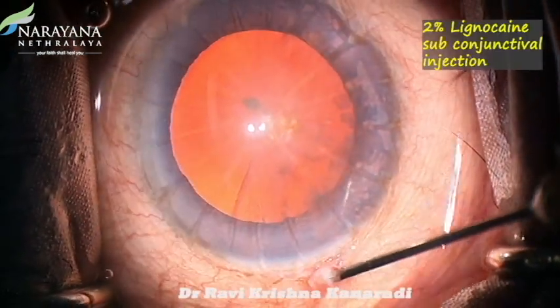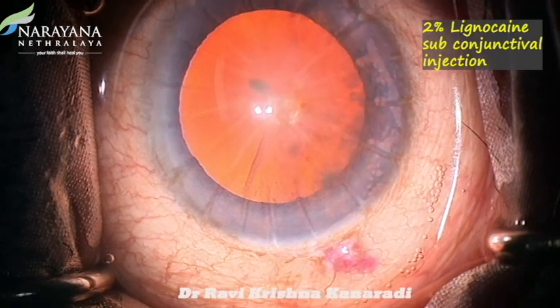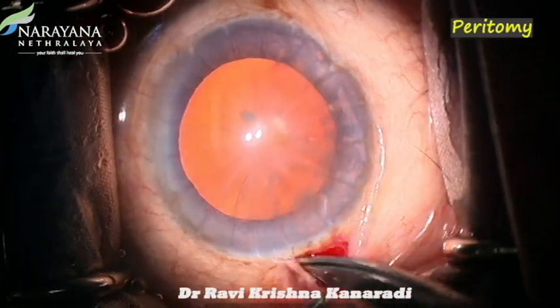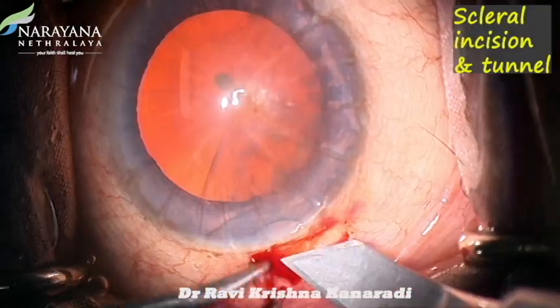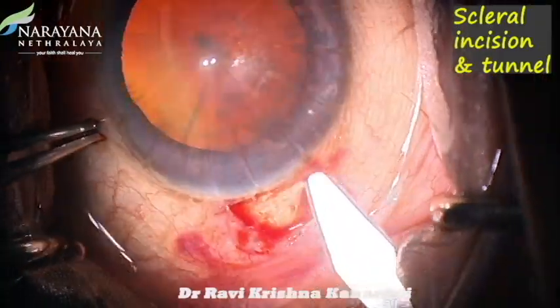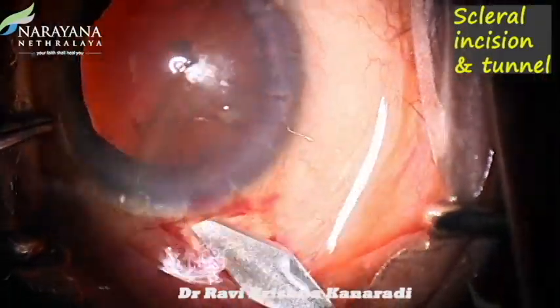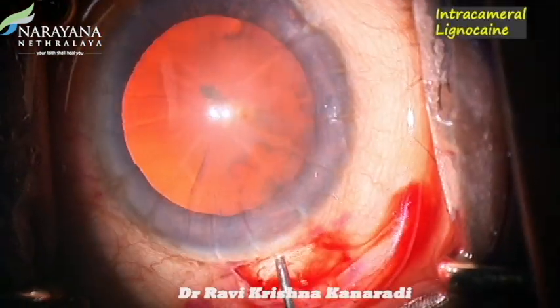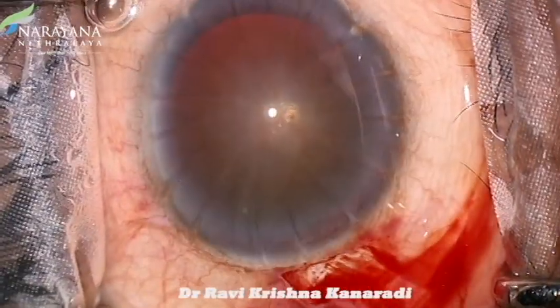We anesthetize the incision site with subconjunctival injection of 2% lignocaine. A small fornix-based conjunctival flap is created. A 3 mm triplanar sclerocorneal tunnel is made while taking care to avoid entering the anterior chamber across any radial incision. Viscoelastic is injected as and when required.